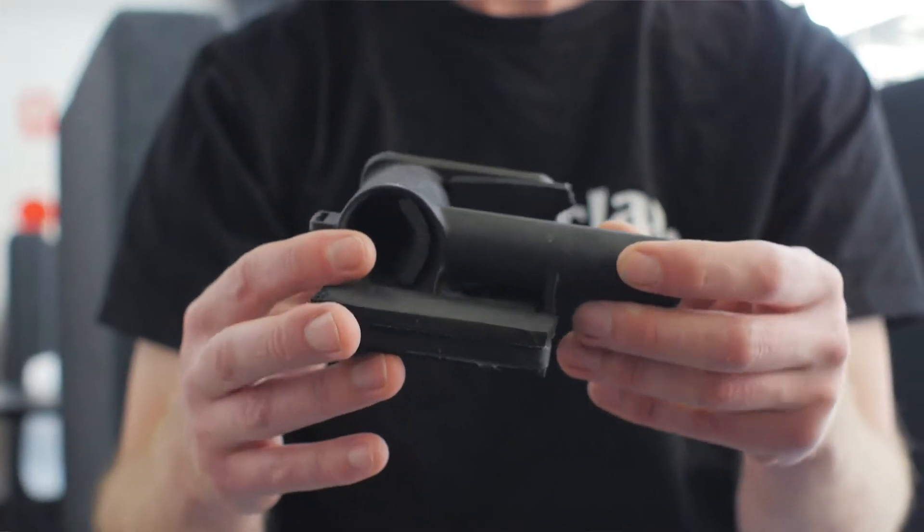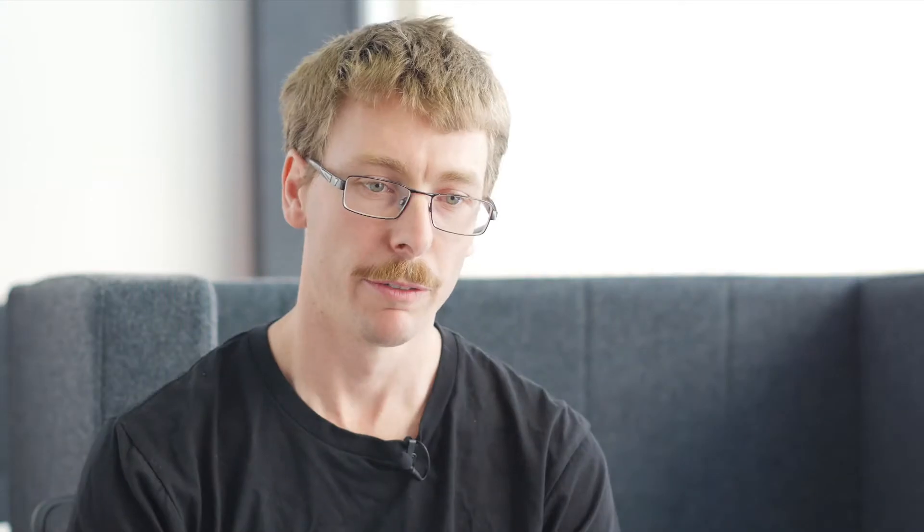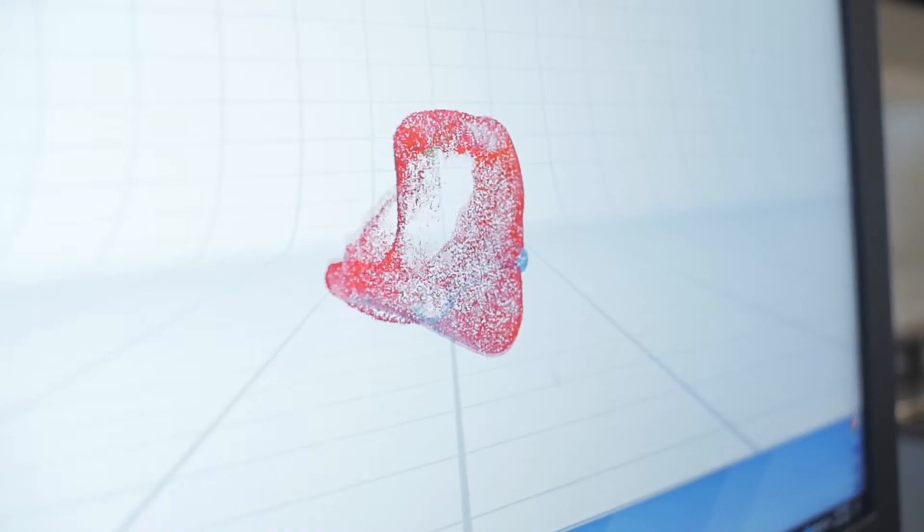The whole benefit of 3D printing and this design process is customisation exactly for that member's needs. For Scotty's, we customised the hand grip and the angle of where it would hit the wheel. For another athlete that would be different because of their arm length and shoulder distances.